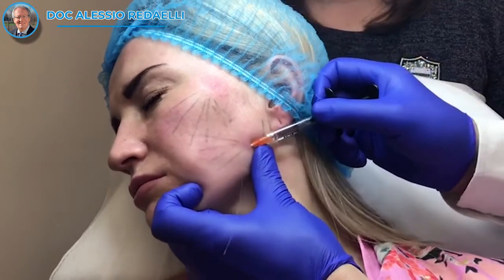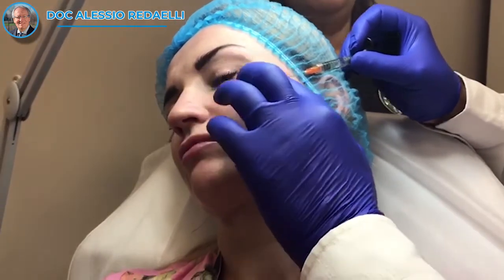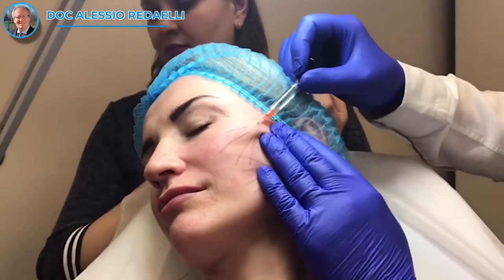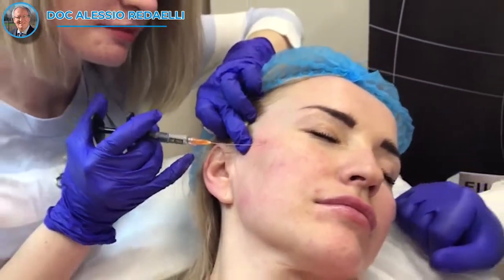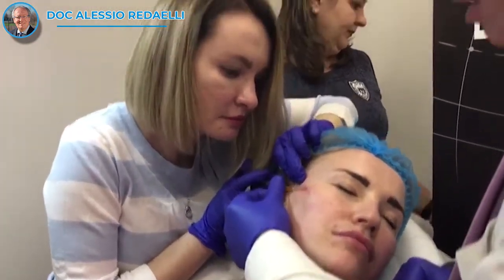Now it is much easier for the cannula — you see the projection. Stay superficial this way; you see that going this way you remain superficial, but if you go this way you go deep.